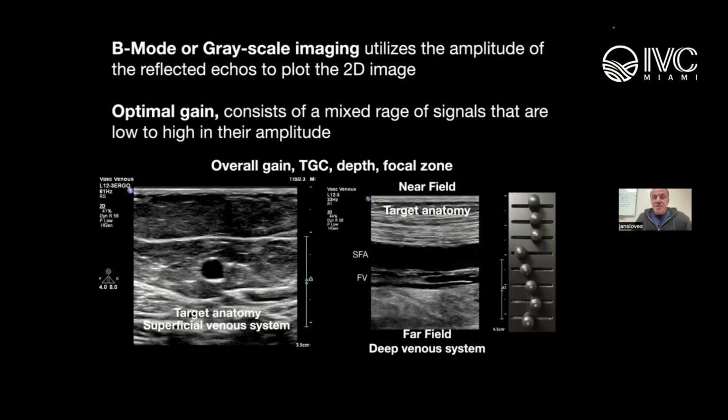And gain is usually a knob that one can adjust. And the TGC, you've got the lever action there on the slide that the operator adjusts also. So a lot of this is operator dependent, correct? Oh, absolutely. And this particular image that you're seeing here is the image created by that TGC alignment. So again, a very important control. If you're not putting the probe on, seeing the field, and actually doing adjustments as you scan, you're not going to get an optimal image. It's constant adjustment, I'd imagine, correct?